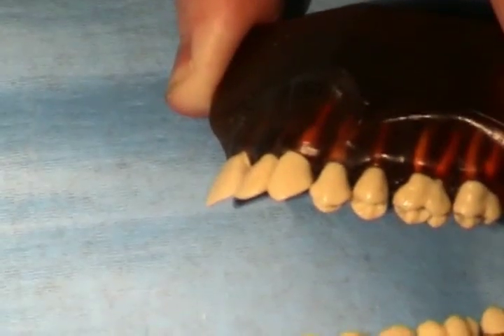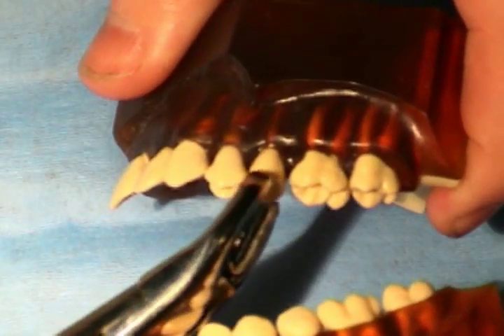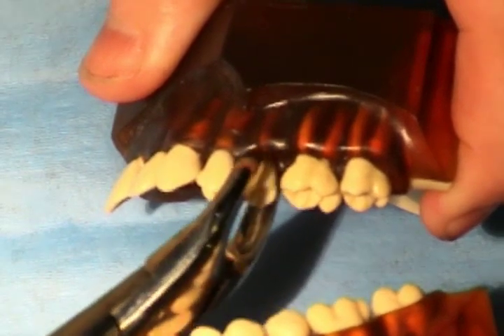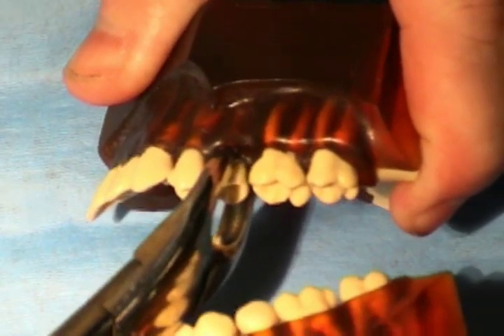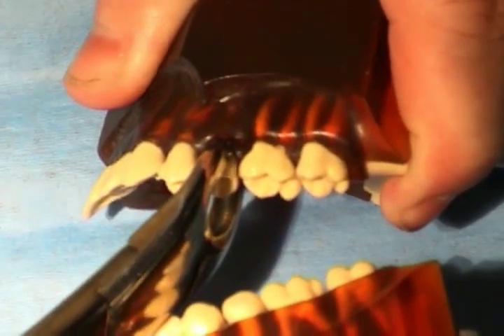An upper universal forceps number 150 is chosen for this extraction. The forceps is seated with strong apical pressure to expand crestal bone and to displace the center of rotation as apically as possible.